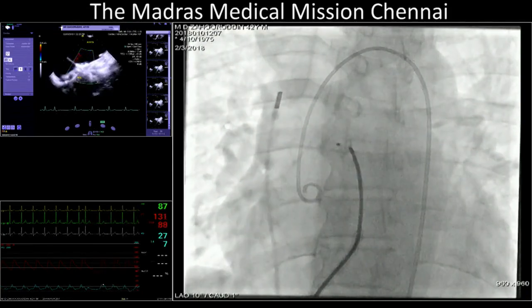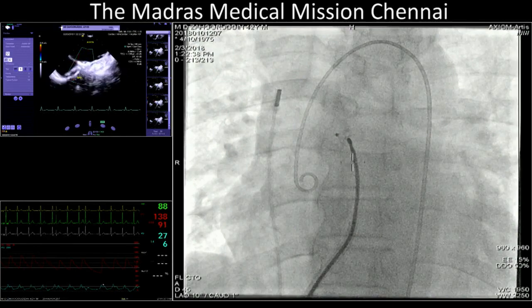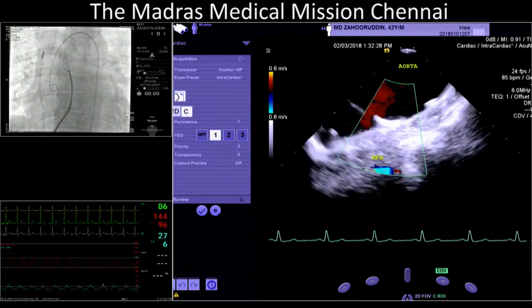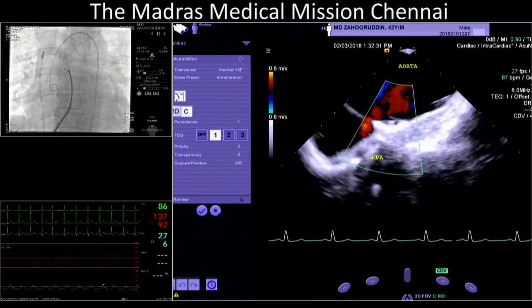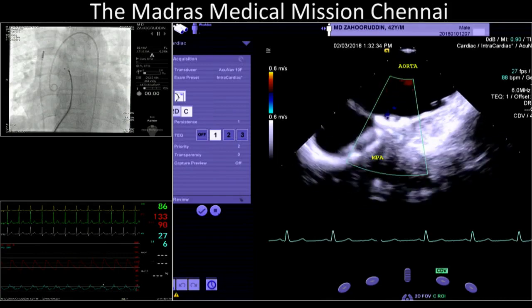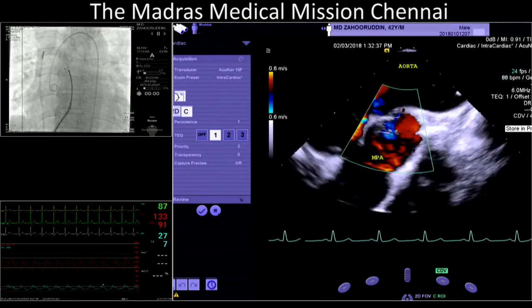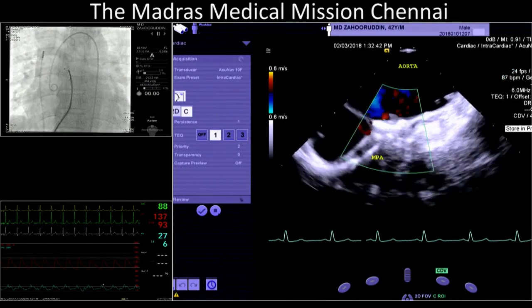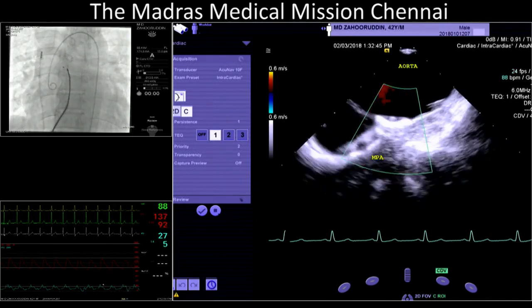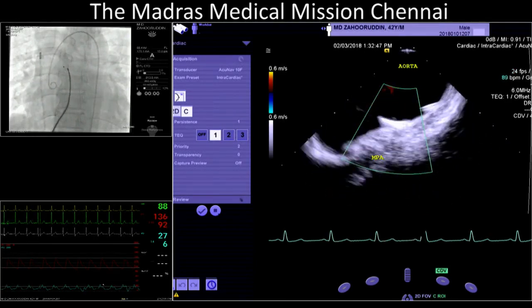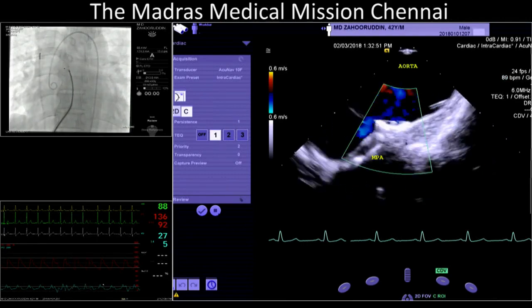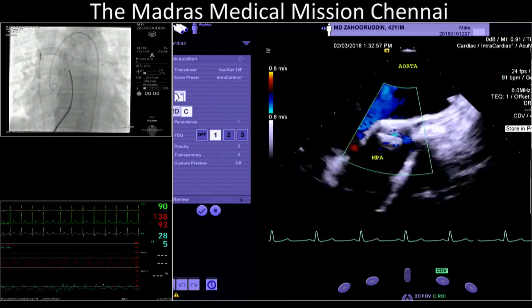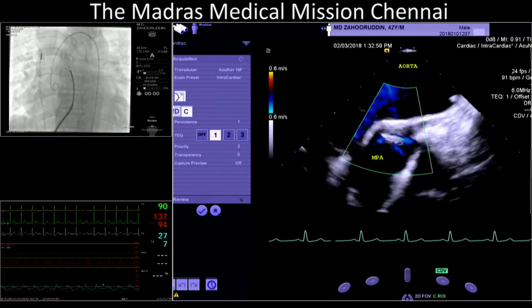Make the echo bigger. Can you see that there is no continuous flow from the aorta into the pulmonary artery? Can you see that, Dr. Dietmar, on the echo? Yes. Do you want contrast through the long sheath on the pulmonary side? I will give it from the aortic side.